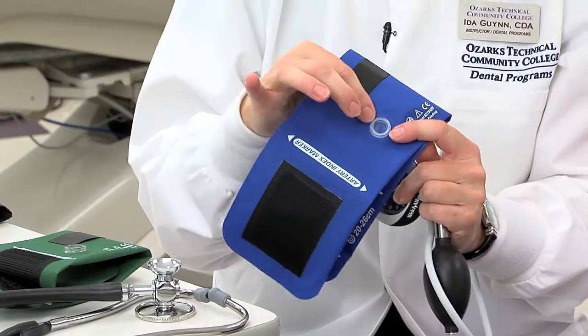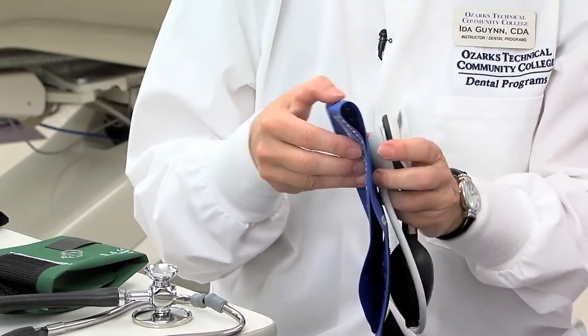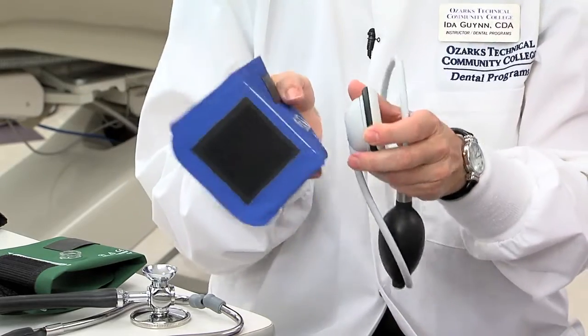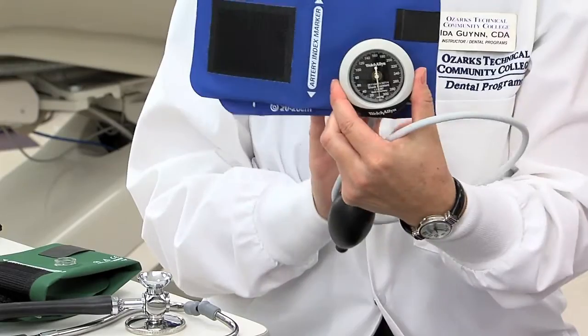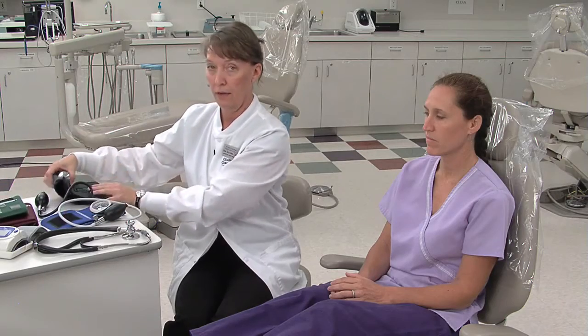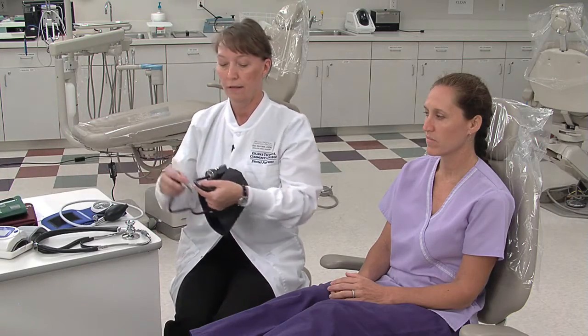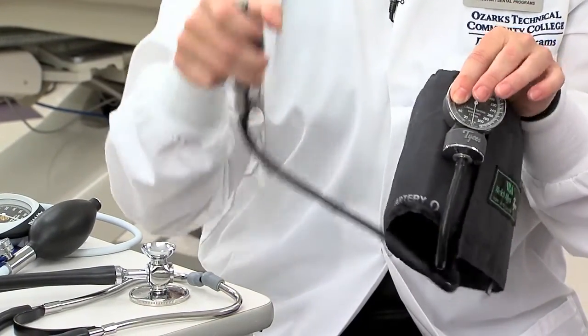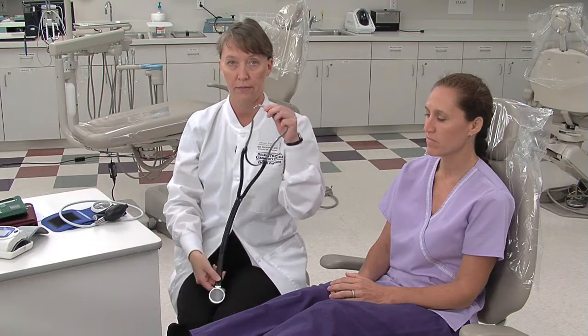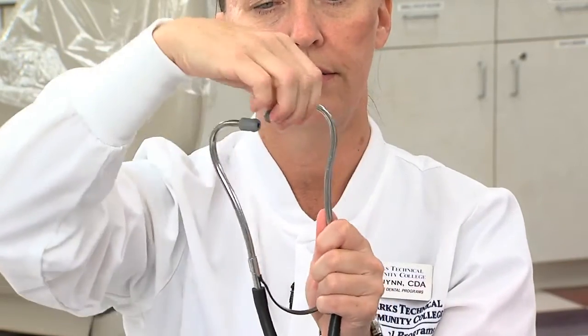To attach the meter to the cuff, you simply take it and press it into the port, and it snaps into place. The other type of cuff that we have, the meter is actually attached to the cuff, so it can't be moved. The other piece of equipment that you will need is your stethoscope. You want to make sure that the angle of the ears are pointed in so that they fit into your ears comfortably.